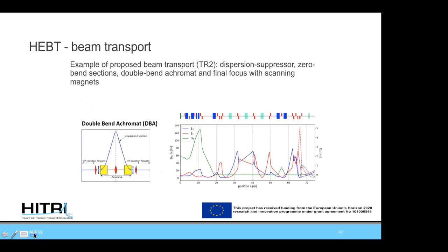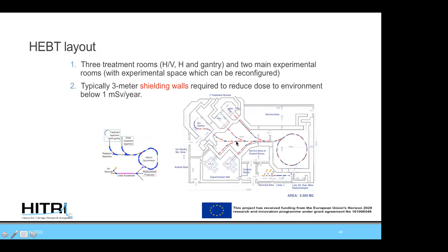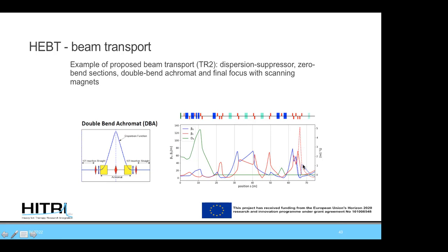Just this plot here on the right, this is a typical setting of the beam line. Here you see the end of the synchrotron, the septa of the synchrotron, which are still synchrotron magnets. Then we have this part, which is the dispersion suppressor. The beam is transported, it's actually shown on the next slide, the setting of the second beam line. The beam is transported through the dipoles, which are switched off, and then is focused on the patient. In this particular case, you have two solutions for the beam spot on the patient: a small one of 4 millimeter, and a large one of 10 millimeter. This is one of the typical plots you have to produce in order to set up the right beam to the patient.